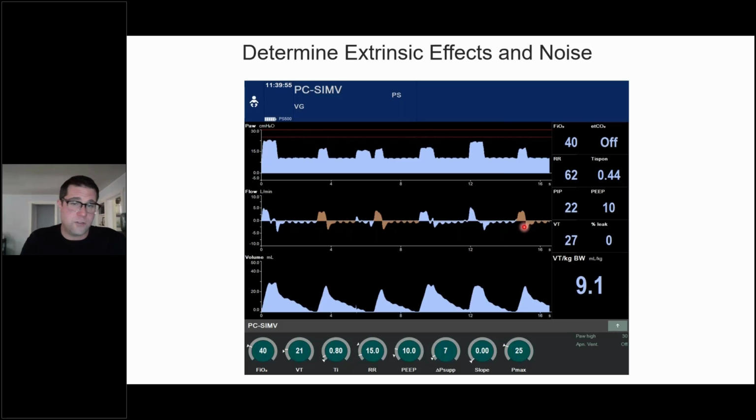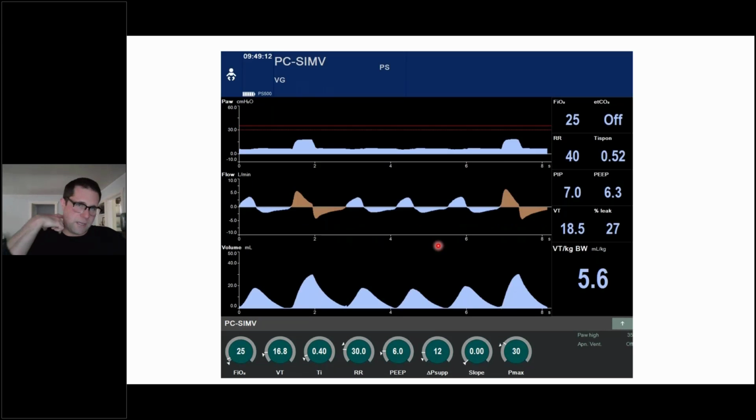And so the heart can trigger a ventilator. We know that. We've done apnea tests on patients, and we've seen that if they're on dopamine or epi, obviously you can trigger a mechanical ventilator because it's all within the same cavity, right? The heart's beating away. That can cause some changes in pressure and volume and flow within the actual trachea that will trigger a ventilator. And so, keep that in mind when you're taking care of these patients.